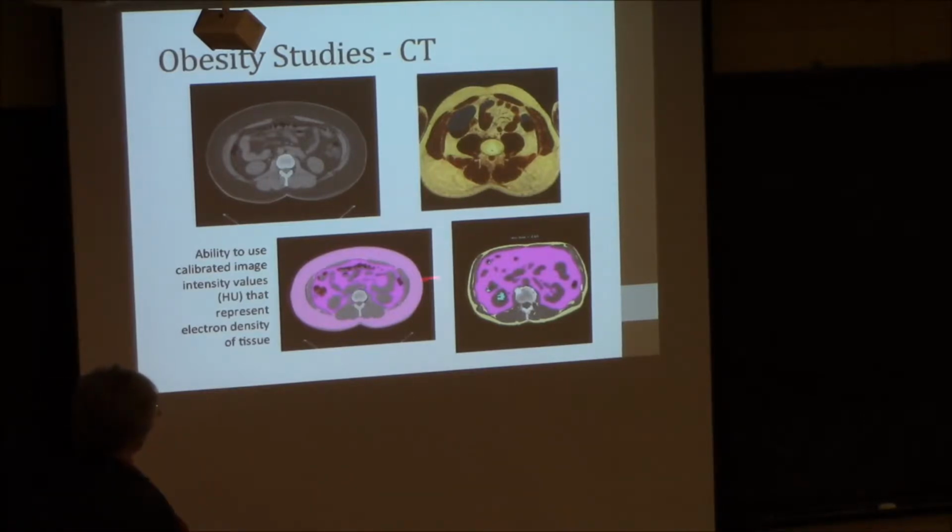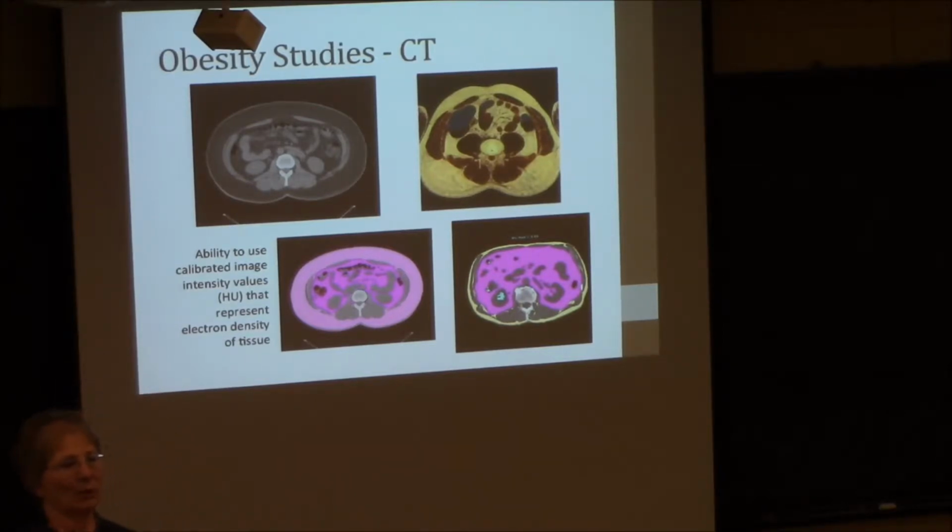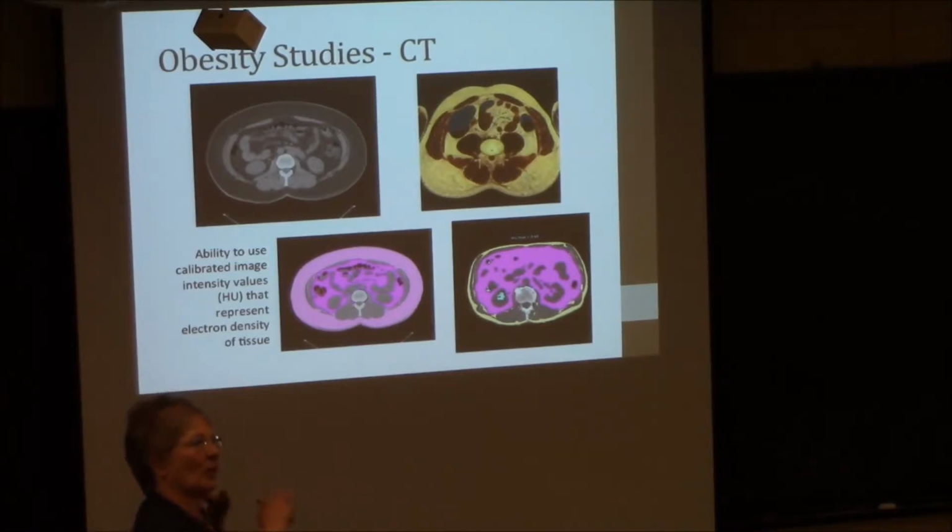But you can see how two people with kind of the same girth look quite different inside. I often say that's a picture of myself I never want to see, but the reality is, we've done thousands of these over the years, and people differ greatly. We use cross-sectional area measurements. The problem with CT is you don't want to do too many cuts because it is radiation, so you do 1 or 2 at most, and then you assume something about the whole body from that. There are issues that complicate it, like if you have some fat in your bowel, then it'll look just like fat. You have to figure out how to eliminate that. But for the most part, it's fairly easy to do, fairly accurate. And that was nice for a while.